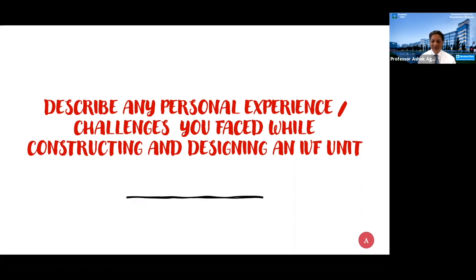Believe me, because this is a very important area. You need to be able to have a very reliable quality of gases that are being used for culturing the embryo. And if that is not really verifiable and certifiable, then everything that the embryologist is working on can be compromised, as you rightly said. So perhaps something to consider.